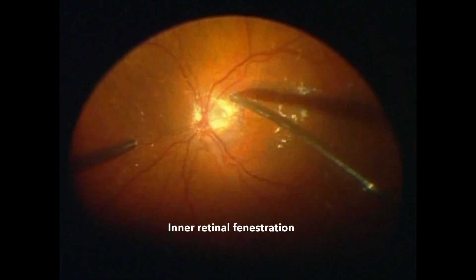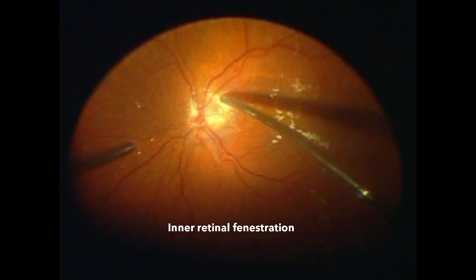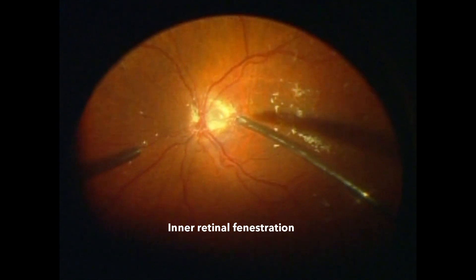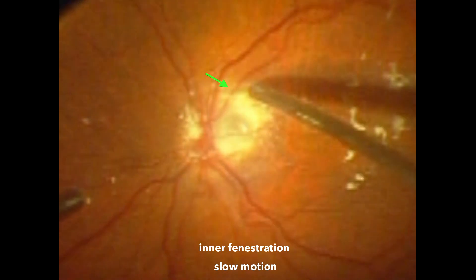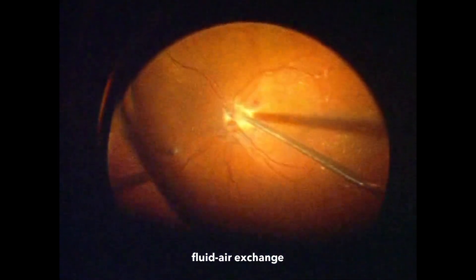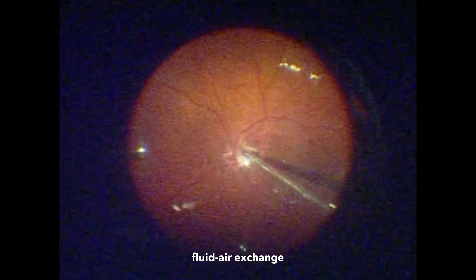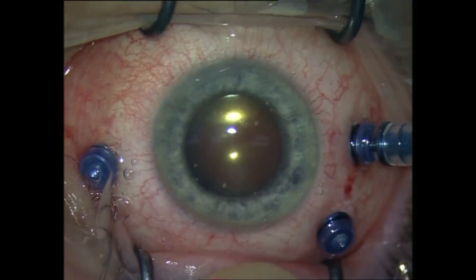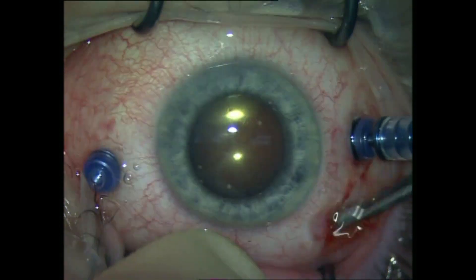Using a 25-gauge needle, a partial thickness retinotomy was made just temporal to the optic disc pit under high magnification. Showing the step again — the needle is making the partial retinotomy. This was followed by direct fluid-air exchange, and the surgery was concluded in the usual fashion.